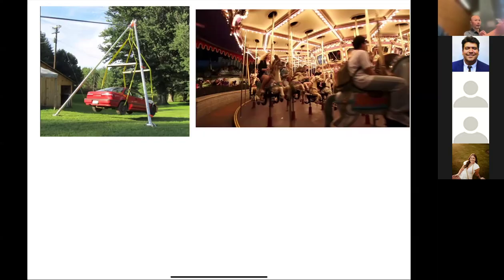So the merry-go-round is going around like this, right? What should you do to pull your friend off the merry-go-round? Go ahead. You've got to run with them, right? And you're running with them, applying up to 1 pound of force, and eventually you'll be able to pull them off. So that's essentially what the B1 field is doing. It's going around with the spins as they precess. Every time, you're just getting it to move, and then you have to go along with the field to get it to come down. Okay. So the merry-go-round picture is very much analogous to what the B1 field is doing, because the B1 field has got to go around and essentially pull that spin down to where it wants to go. Okay.